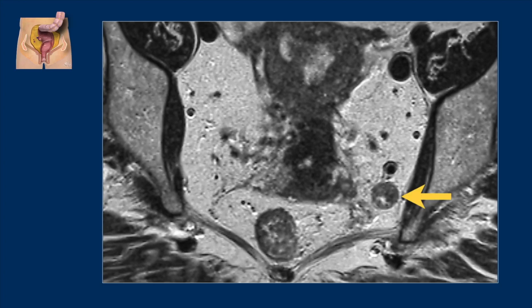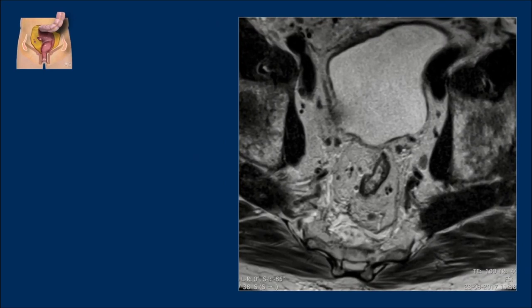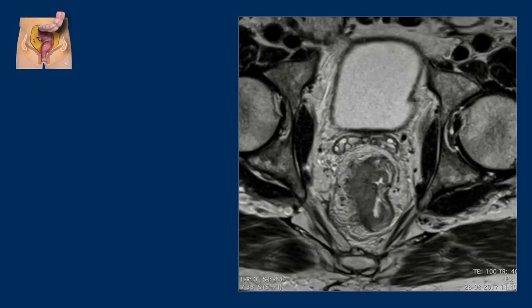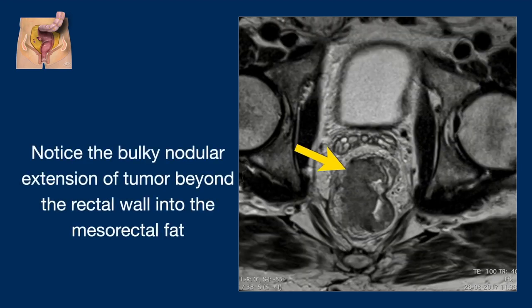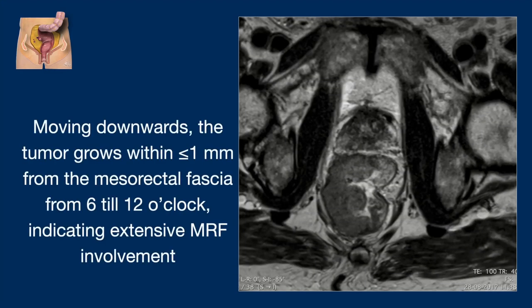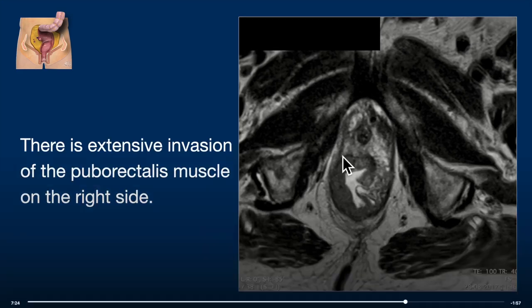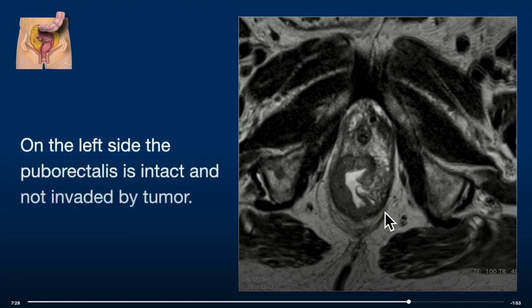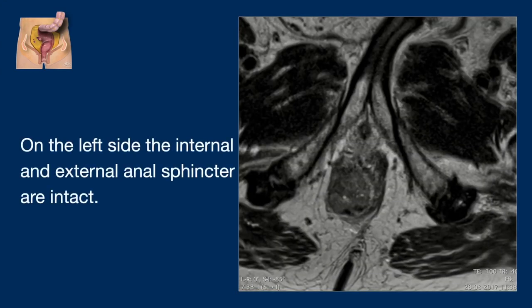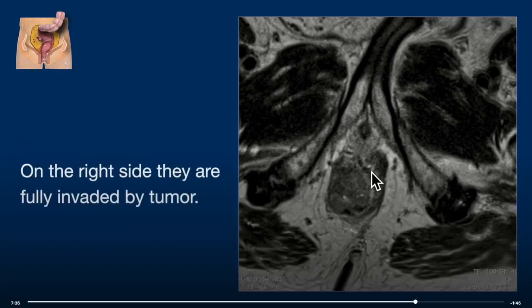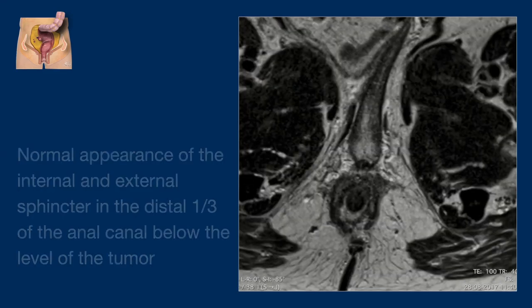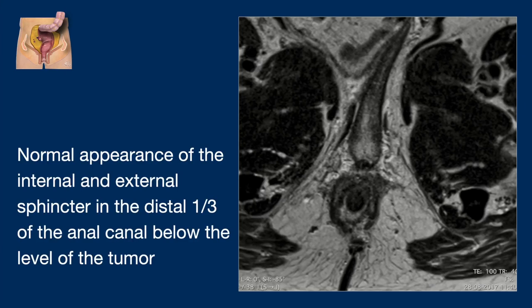Back to our case — on the axial slides at the pelvic floor and anal sphincter, notice the bulky nodular extension of the tumor beyond the rectal wall into the mesorectal fat. Moving downwards, the tumor grows within less than 1 mm from the mesorectal fascia from 6 to 12 o'clock. There is extensive invasion of the puborectalis muscle on the right side, while on the left side it is intact. On the left side the internal and external anal sphincter are intact, while on the right side they are invaded. The internal and external sphincter of the distal third of the anal canal below the level of the tumor appears normal.